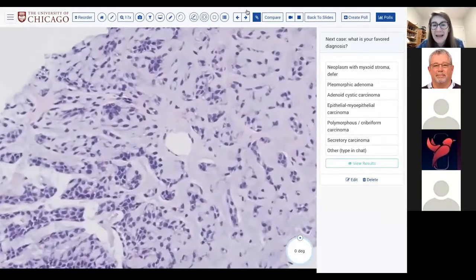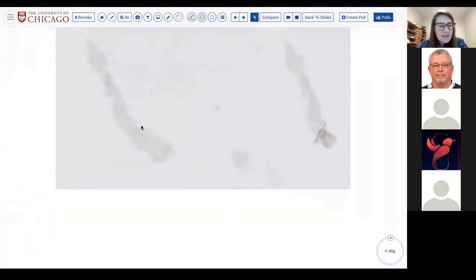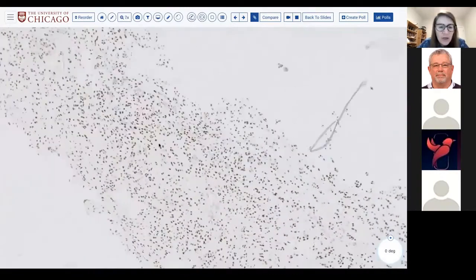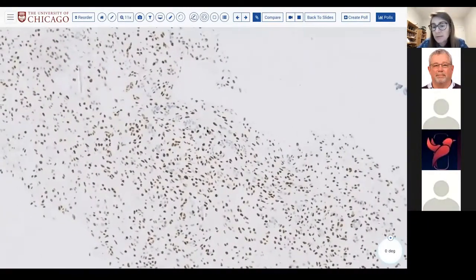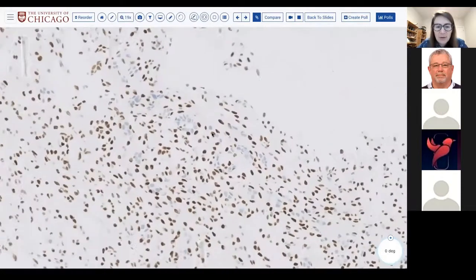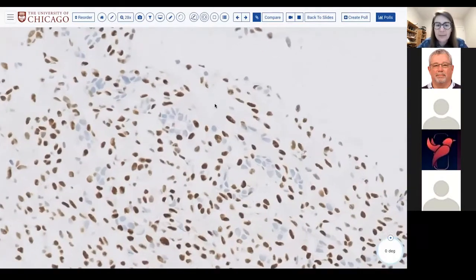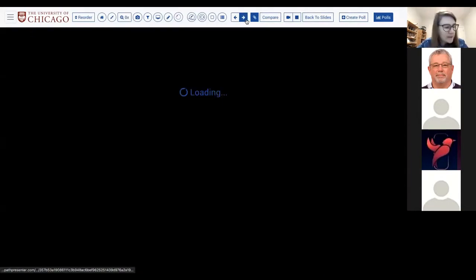So you'll start to see a pattern here in my approach to the immunostains. One, does it have two cell types? In this case, I'm showing you P63, which would be the equivalent in this case of P63/P40. Liam has an adenoid cystic going on in there. And in fact, there is a P63/P40 positive population and a negative population. So this is a biphasic neoplasm.